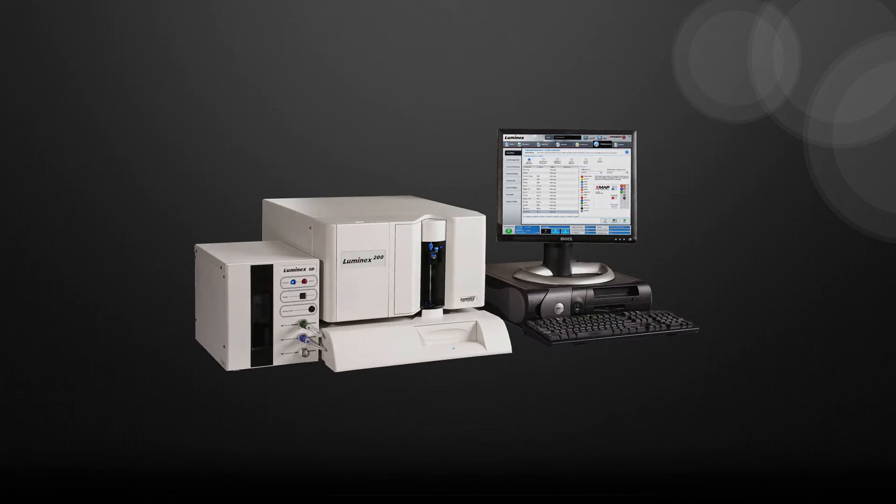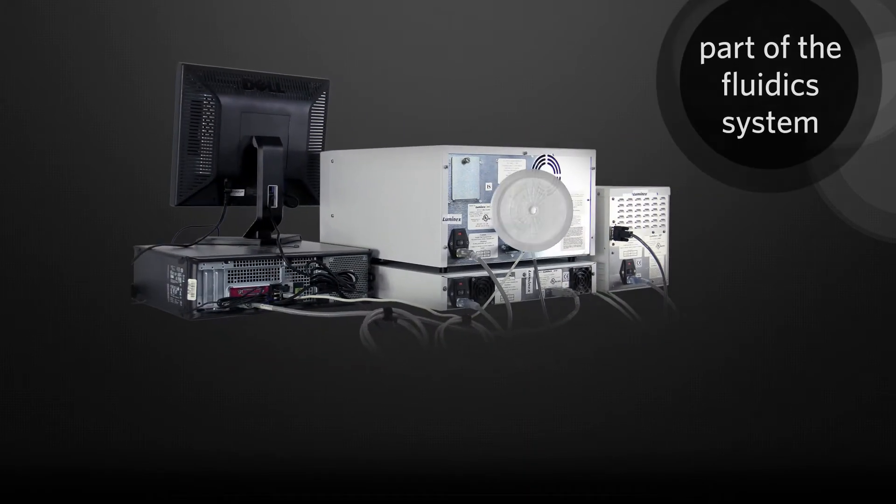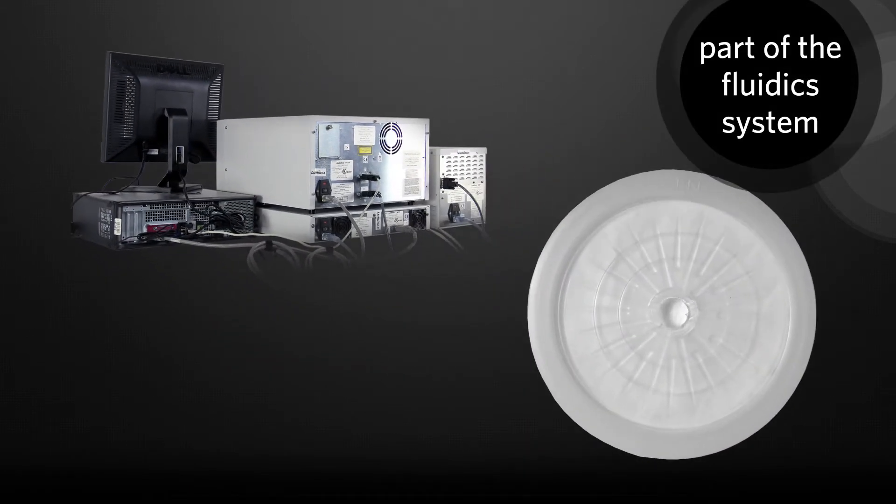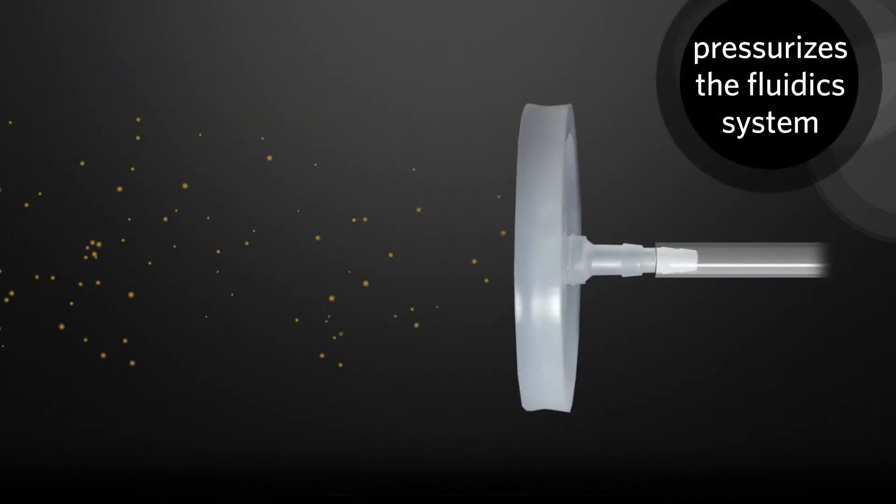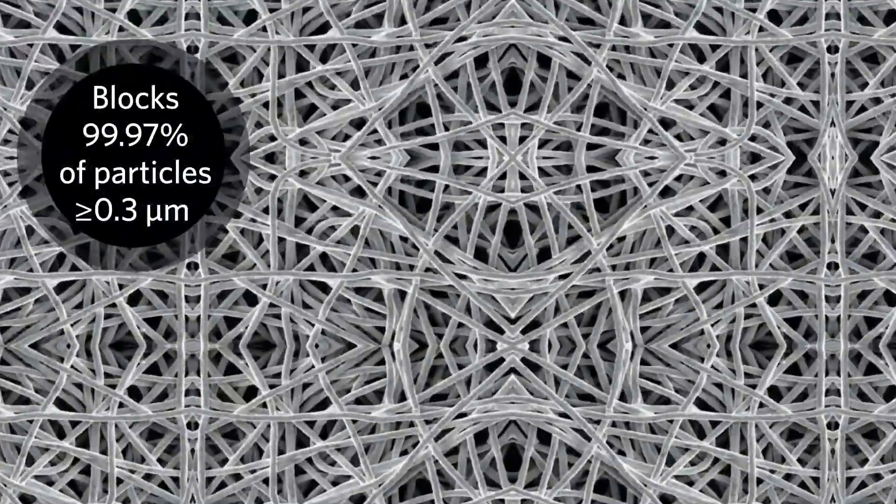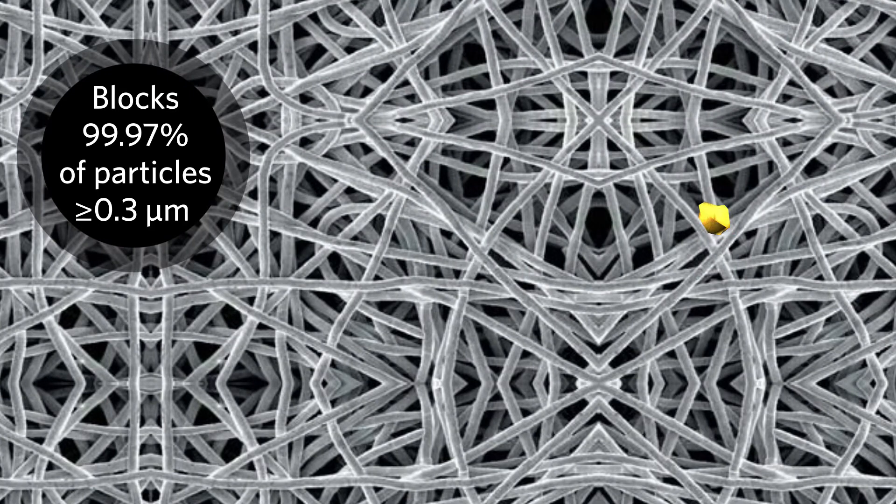Why should I replace the air intake filter? The analyzer air intake filter is part of the Fluidix system on the Luminex 200. Air is pulled into the system through the filter to pressurize the Fluidix system. It blocks 99.97% of all particles 0.3 micrometers or larger in size.